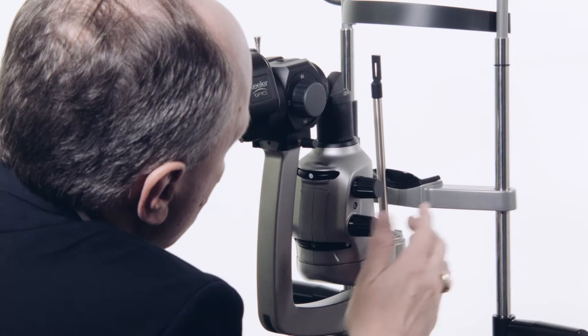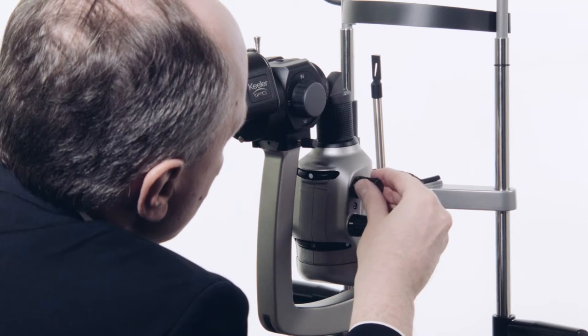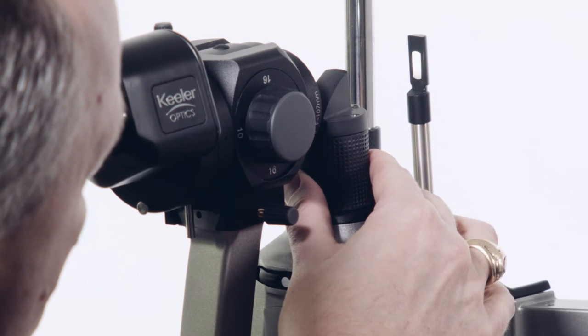Slit angle can be adjusted as required to perform the examination. For finer slit movement and angle, twist the grip on the slit lamp arm.